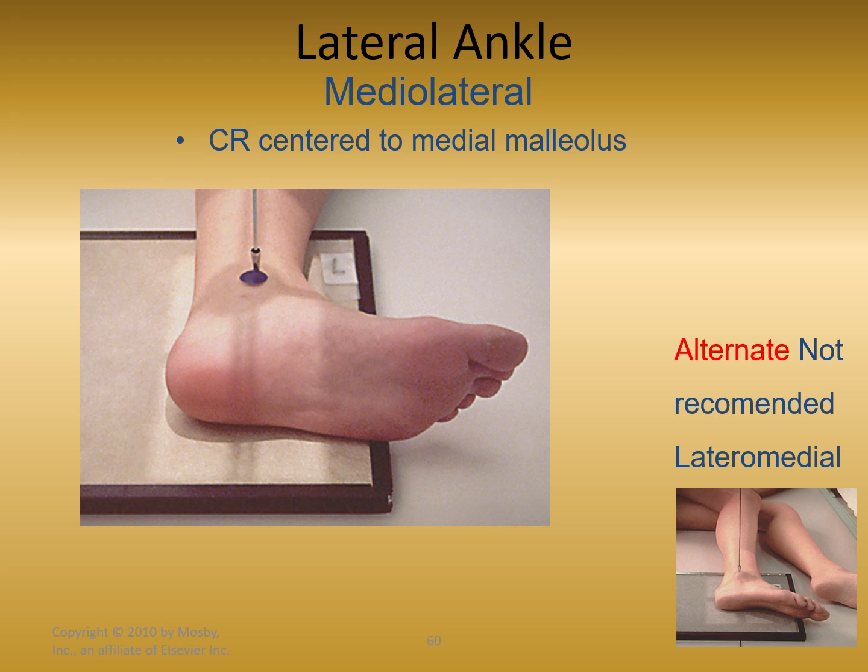Now, I have to show you this alternate position here. This is not the routine way that you would do a lateral ankle. It's not recommended. It is a lateral medial projection. I just need to show you that it's possible. It could be patient condition that caused us to do that lateral ankle in that position, but it is not the way that you want to do it, and it is not the way that you would do it routinely. Our routine lateral ankle position is definitely the medial lateral projection.